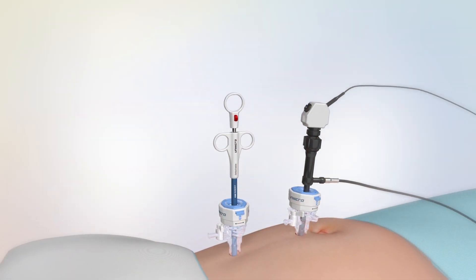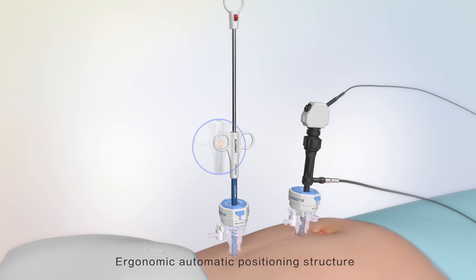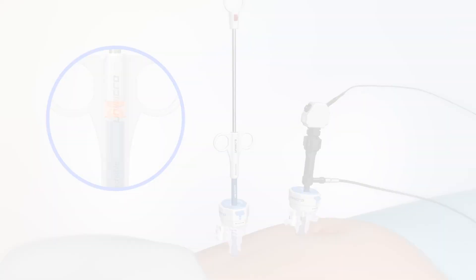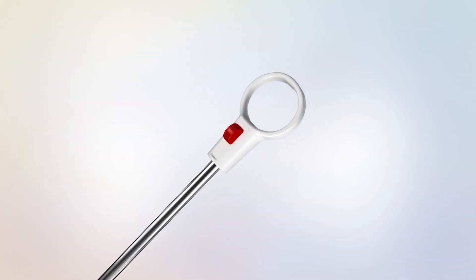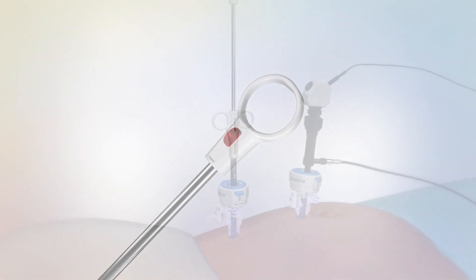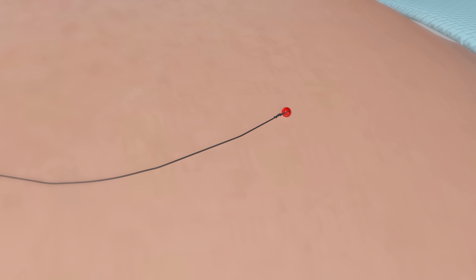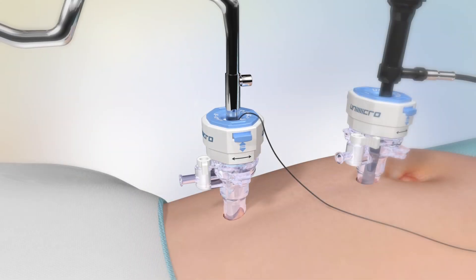When tightening the endo bag under the shaft in the given position, press the red button in the handle to take out the shaft. The string will stay out of the trocar, and the red ball at the end of the string will prevent the string from slipping into the trocar.